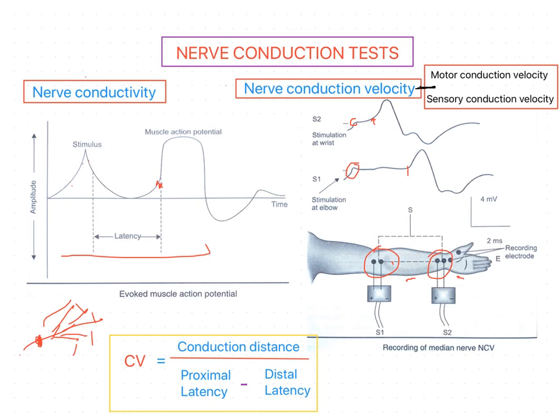So that period is called latency. The latency is measured in milliseconds from the stimulus artifact to the onset of this wave. This wave actually appears as an M wave.